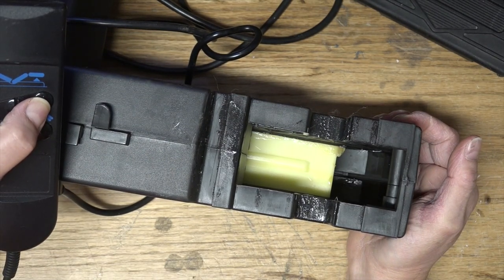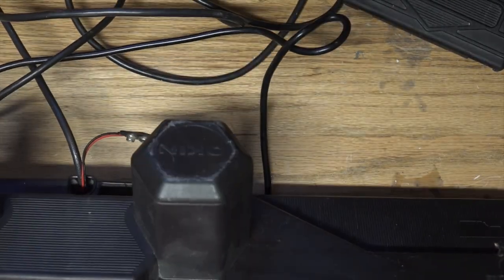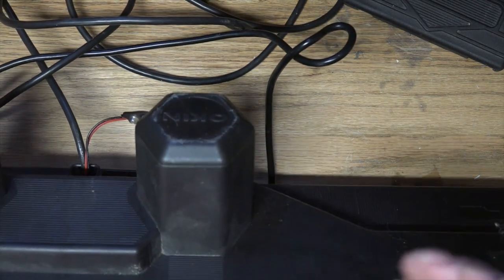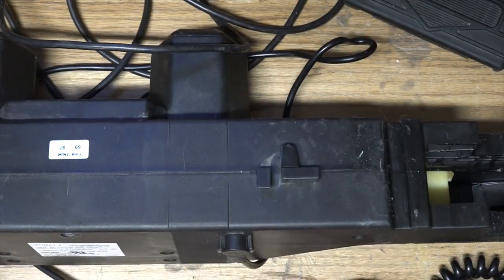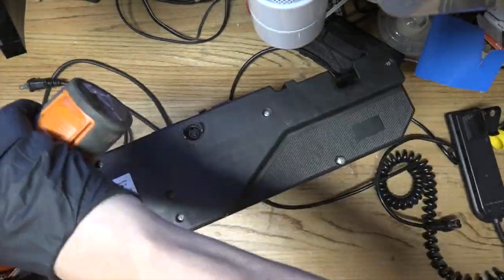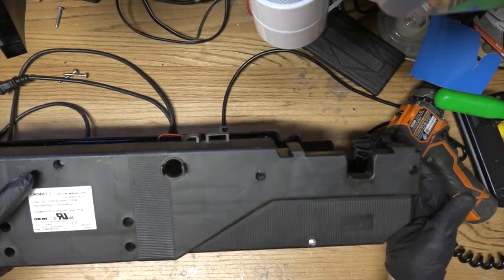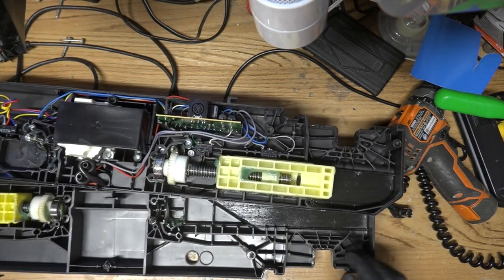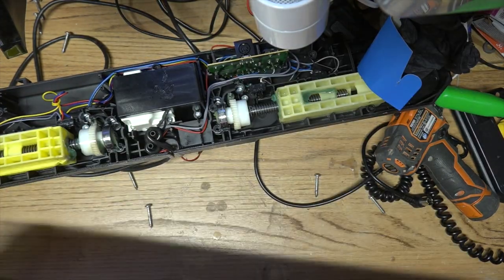exerting lots of force. I don't think I really have a use for this as it is, but I'd like to take it apart and see what's inside, and maybe take the motors, even though they are intermittent. See if we can save some of the transmission for another project. I don't know, but let's take a look inside anyway. Come on, OKIMAT. Ooh, it's heavy. Let's do stuff on this side. Ooh, some of the parts got stuck in here.